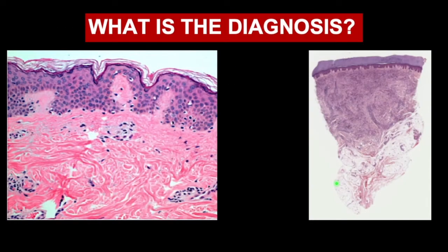So you can pause the video now in order for you to identify the diagnosis, and try to look, compared to the normal skin, what do you see different? What is the pattern here if you look into this lesion? So in this lesion, we see in the dermal area, the epidermis appears uninvolved, intact, but the dermis appears very busy with all these blue, kind of purplish formation.